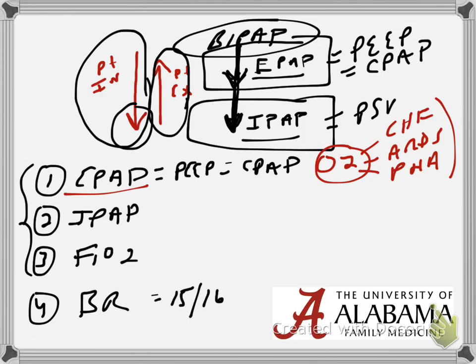IPAP, on the other hand, which again, remember, is the same thing as pressure support on mechanical ventilation, is all about your ventilation.